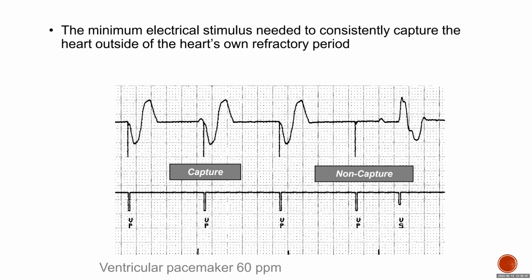How do we assess that? We go to the patient and put on the ECG, we start pacing and dropping the output, and we see when we lose capture. So here, for example, we're pacing at 2 volt capture, yes, 1.5 capture, excellent, 1 capture, 0.5 there's a spike but no capture. That means 0.5 didn't capture, and the last one that captured is 1.